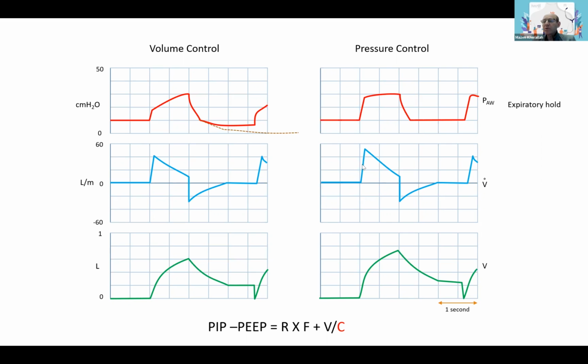Of course, what you need to do is decrease the pressure. If you want to give this patient pressure control mode of ventilation, just decrease the pressure, but you need to maintain adequate ventilation and oxygenation. Thank you.